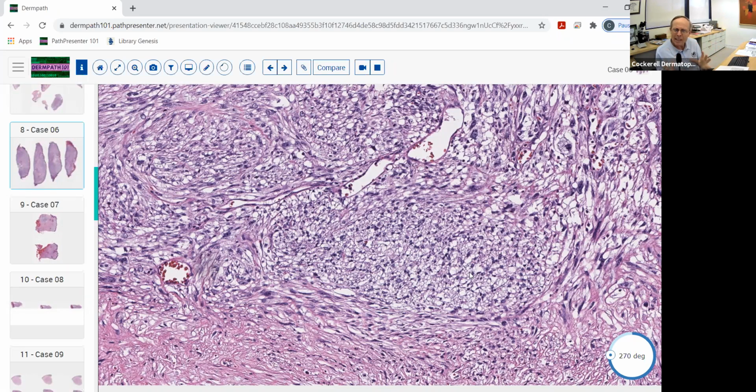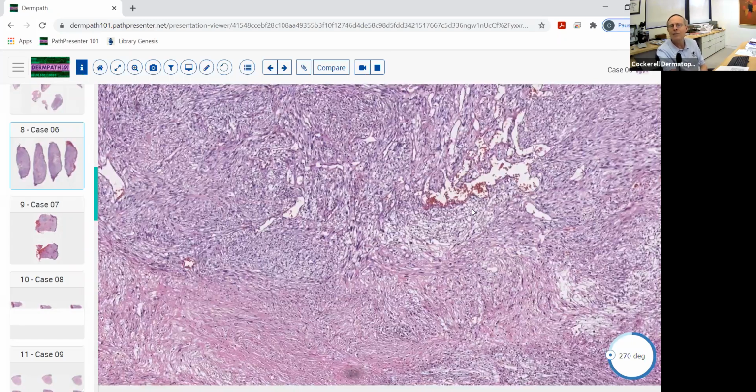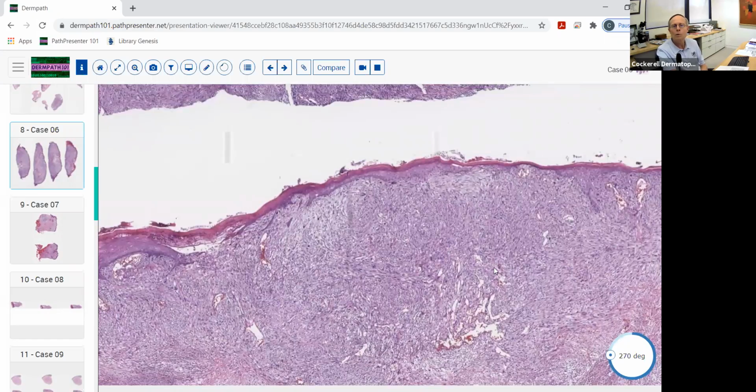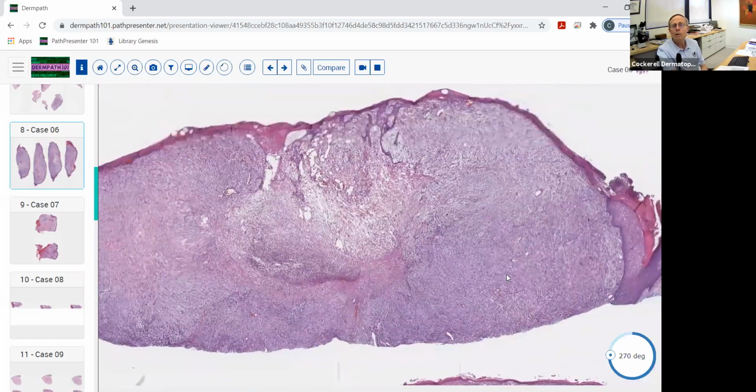So when you're looking at a solid lesion that's got this poorly differentiated malignant spindle and or epithelioid component like this, those are the three things to remember. You don't need a long differential. In dermatology, the longer the differential, the less you know. So it's something to keep in mind, but no, those are the three main ones that you need to think about. So we have a panel of stains that we apply to this.